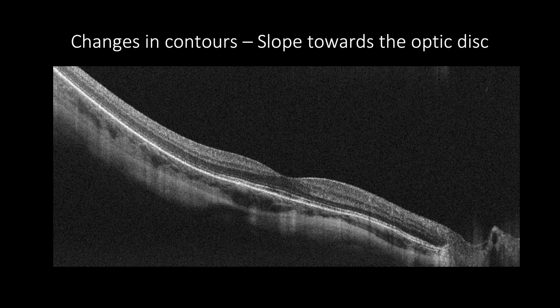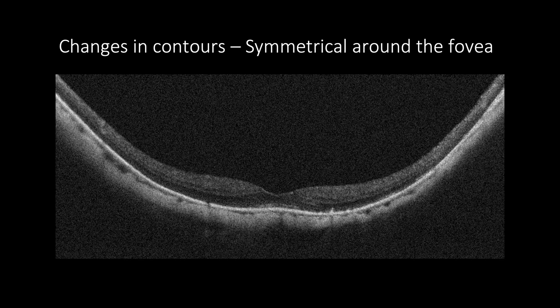Changes in retinal contours are one of the most common features in pathological myopia, showing several patterns, such as straight sclera with curvature slope toward the optic nerve, or concave shapes symmetrical on both sides where the sclera curves posteriorly and symmetrically around the fovea, which appears more posteriorly curved in cases of staphyloma.